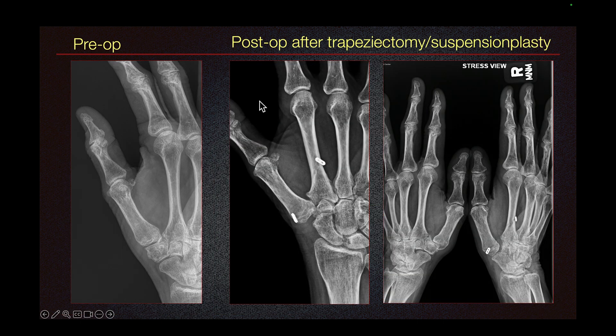This patient underwent trapeziectomy and suspensionplasty. This is the pre-op radiograph on the left. We can see that the trapezium has been resected. In suspensionplasty, the abductor pollicis longus is resected and used to create a suspension to prevent the first metacarpal bone from sliding down. In this stress view, we can look at the left hand and the operated right hand, and we can see the trapezium on the right side is absent.